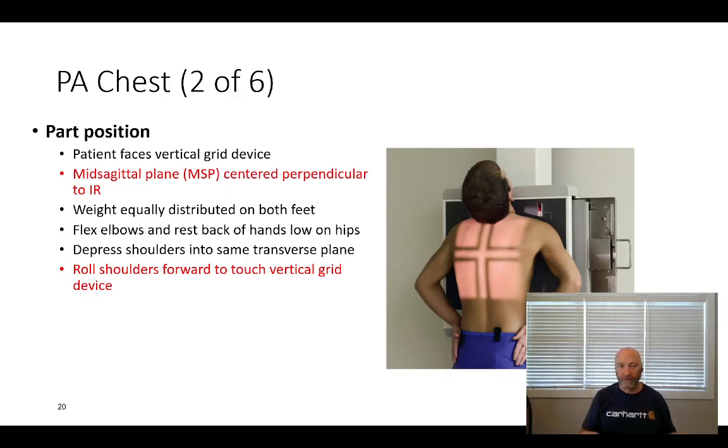In your test questions, I give these test questions all the time, and students fall for them all the way into the sophomore year sometimes. If I ask you a question on mid-sagittal plane, or more specifically on a plane that divides the patient into equal left and right halves, then that's a mid-sagittal plane.